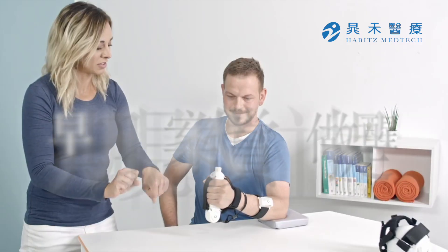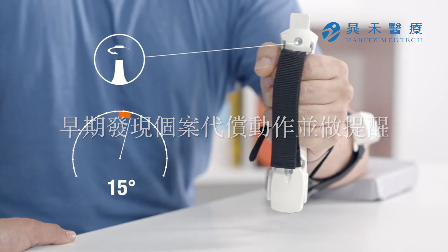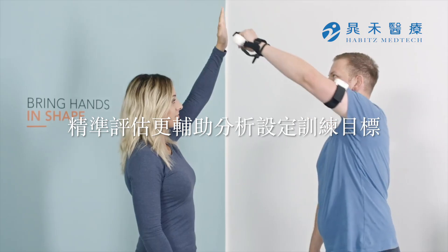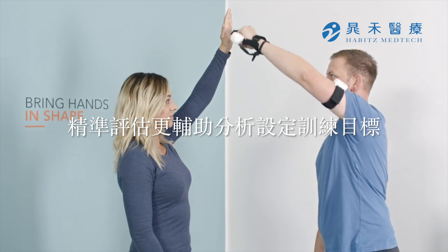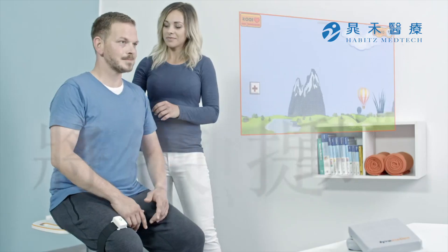Exact measurement of upper extremity joints makes it easier for therapists to detect and correct compensatory movements. The inertial measurement units give the therapist the option to compare differently impacted body parts and introduce the results into their therapy.